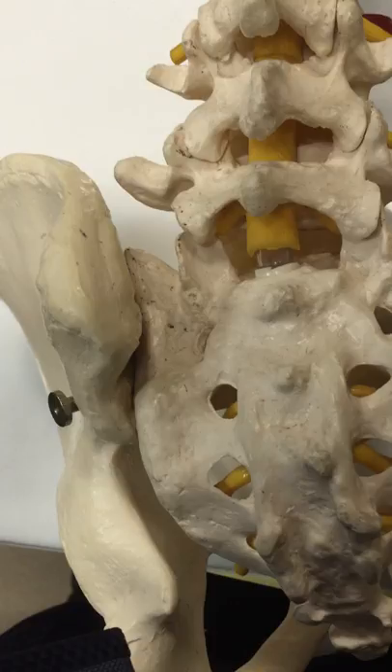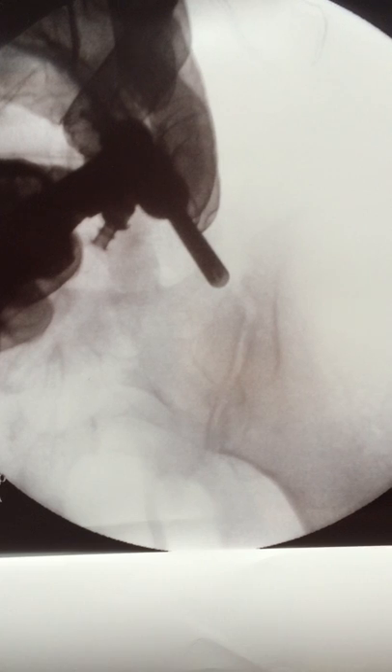I'll put the rhizotomy device through the endoscope right here to ablate the joint, running the endoscope to the bottom and back to the top of the joint to make sure the nerve endings in the joint have been completely ablated.